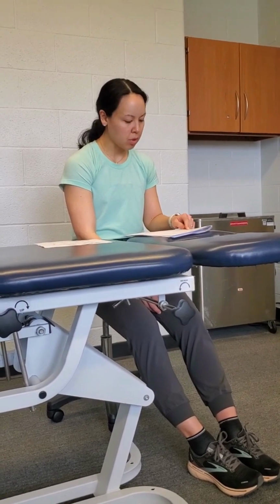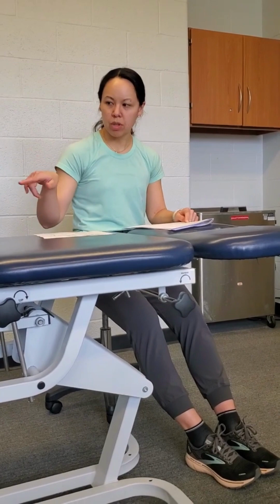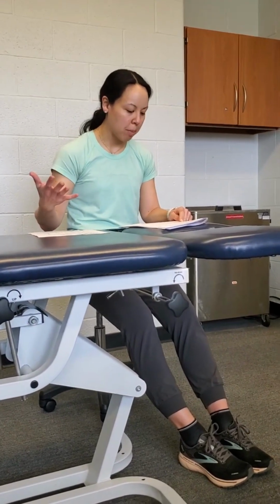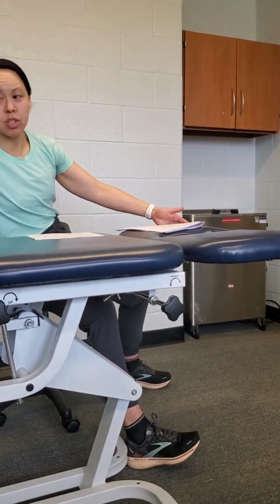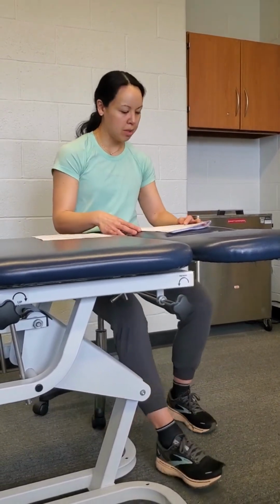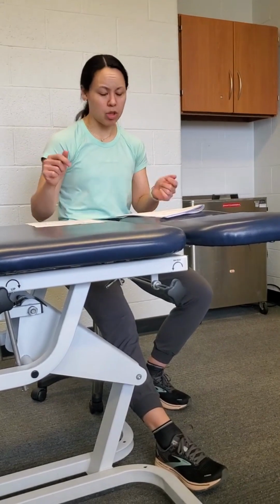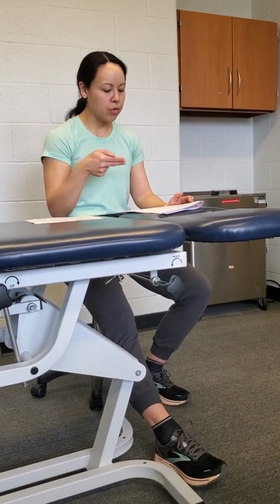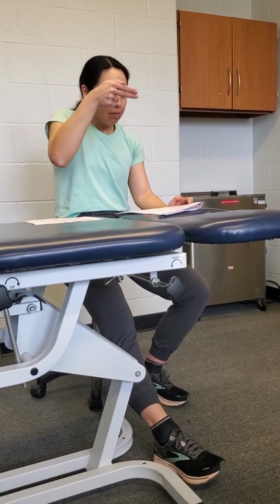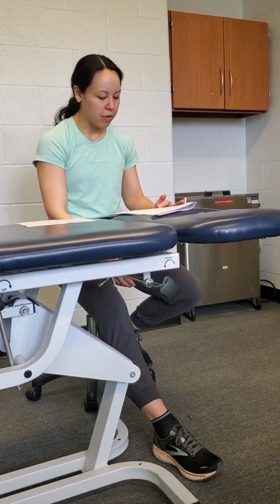So basics, setting up your patient. We'll go over this when we get to the lab session. Selecting the proper cuff: I was just telling them before you got here, red is gonna be upper, unless you have someone with a really big arm, then you might go to blue, and then blue and green are gonna be more for lower extremity. Ensure the Velcro has contact. I'll show you guys how to do that. 2-finger test, right? You shouldn't really be able to get one finger underneath the cuff, between the cuff and the limb.